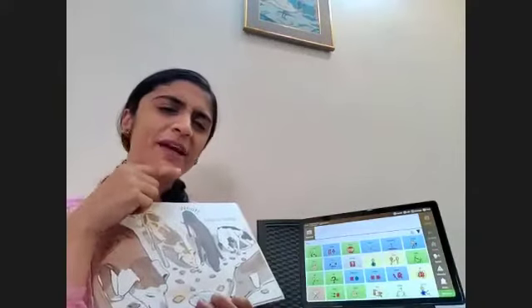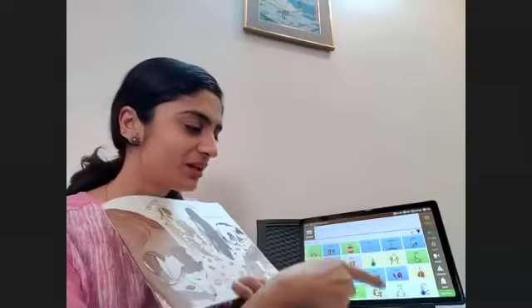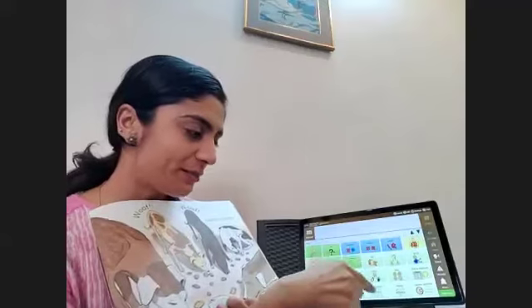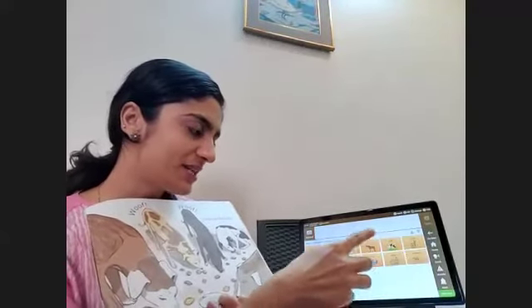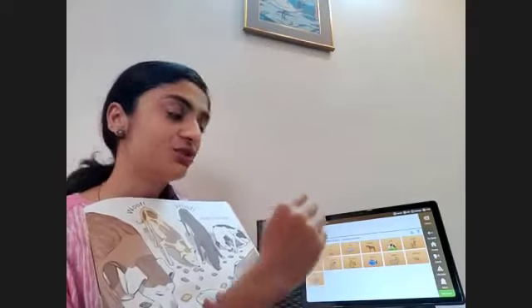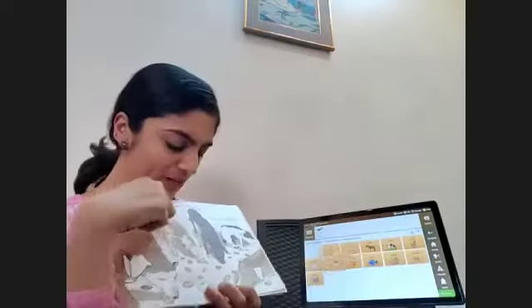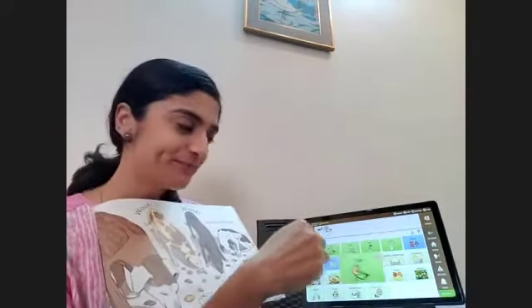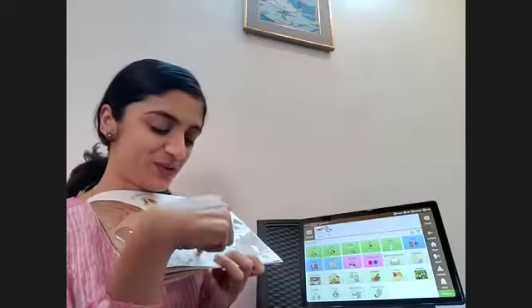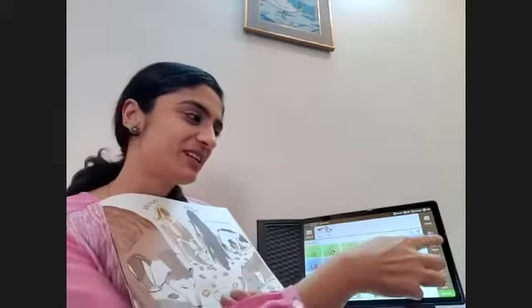So why don't we make a sentence this time? So let's go to our animals. Animals and birds, domestic animals, dog. And then we have to talk about eating. So we'll go back and we'll say eating. And then the last one is the broken biscuits.